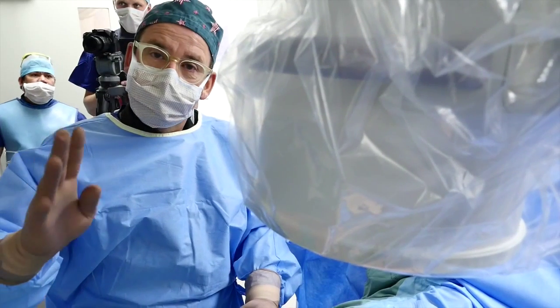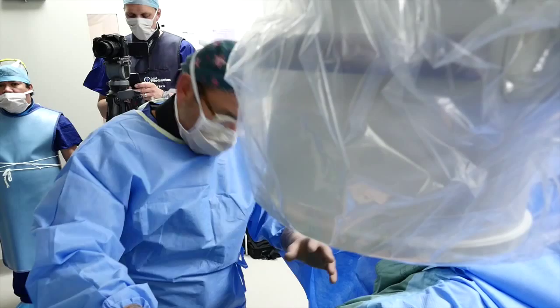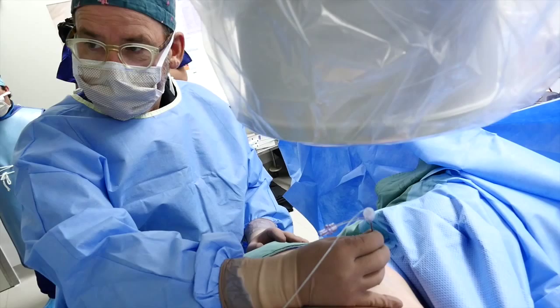What we've achieved is we've looked at this in a lateral and then used a contralateral far oblique to look at the foraminal view, and we can see that the lead is sitting nicely in the foramen. I don't think I can get much more of the lead to pop out, so at this stage we're going to leave it like this.